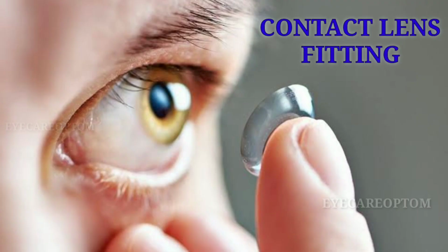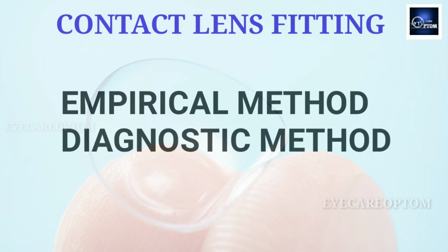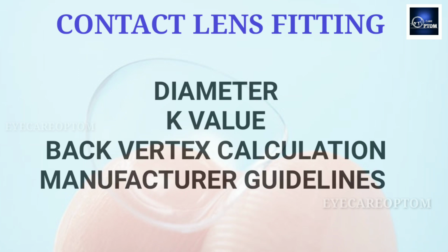Today I'm going to discuss contact lens fitting. When it comes to contact lens fitting, we have two methods. One is empirical fitting, the second one is diagnostic fitting. Both the methods are based on total diameter, keratometric reading, back vertex calculation and manufacturer guidelines.